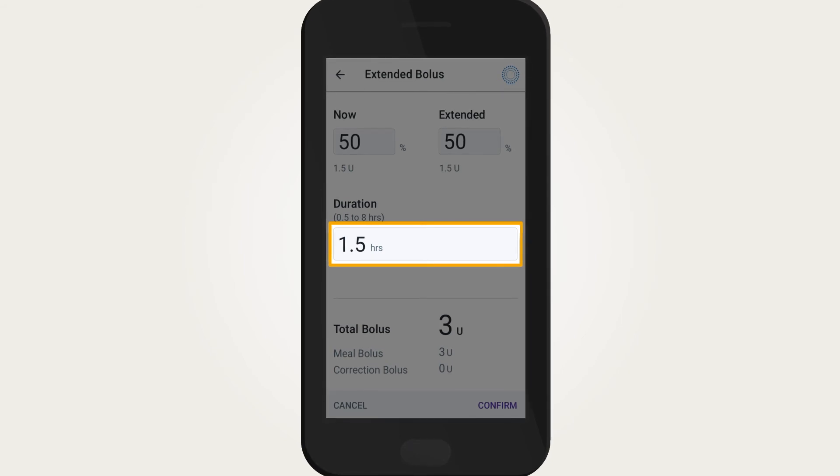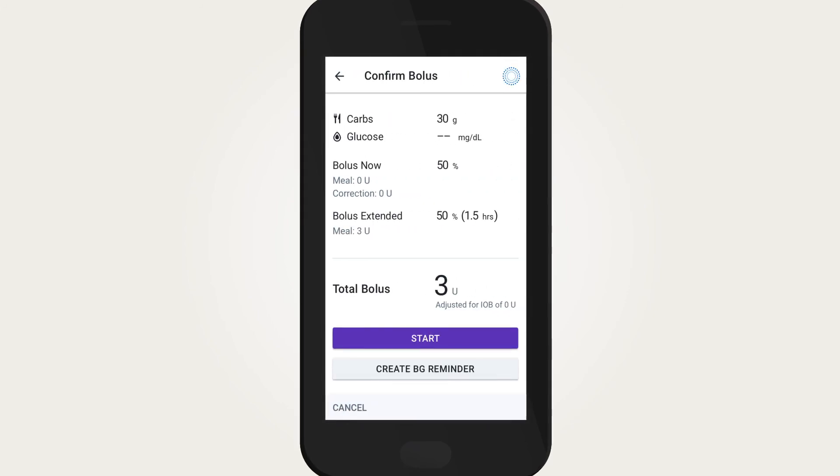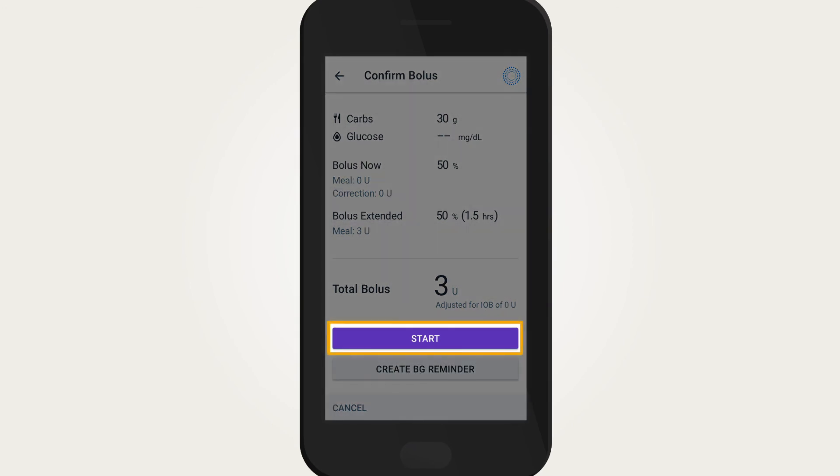Only the meal portion of the bolus can be extended. The correction portion of the bolus, if any, is always delivered immediately. Confirm the final values, then tap Start to begin delivery.